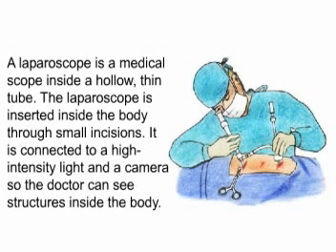What is it? A laparoscope is a medical scope inside a hollow, thin tube. The laparoscope is inserted inside the body through small incisions. It is connected to a high-intensity light and a camera so the doctor can see structures inside the body.